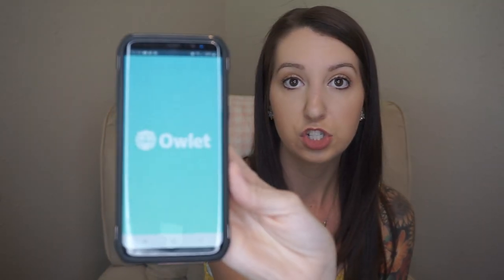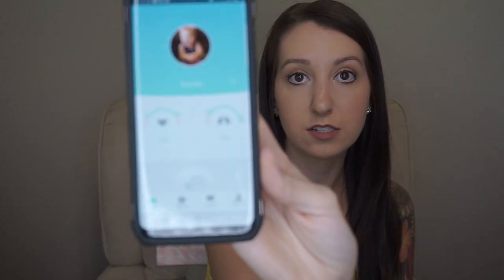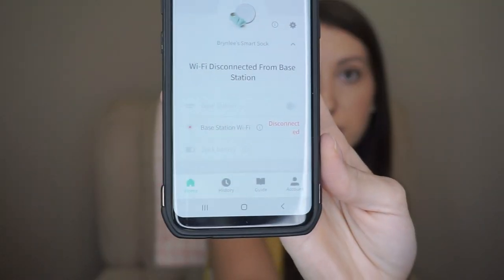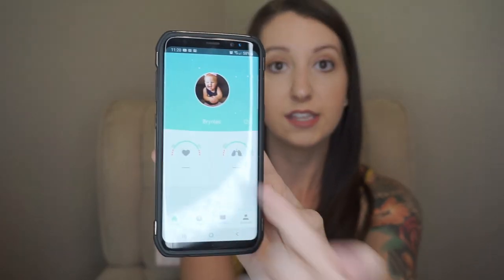This does connect to an app on your phone. I have it right here on my home screen — you can see her picture. Obviously her levels aren't reading anything because she's not wearing it, and it says disconnected from base because I have it unplugged for the video. But I leave this screen up all night long on my nightstand and it tells me exactly what her heart rate and oxygen level percentage are.